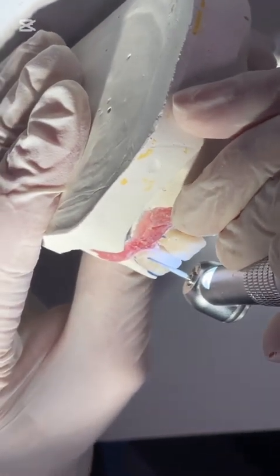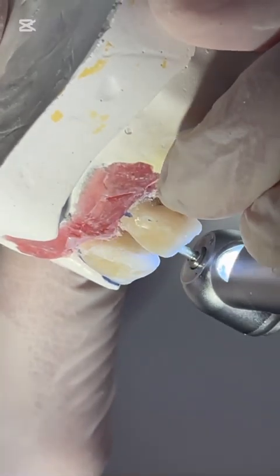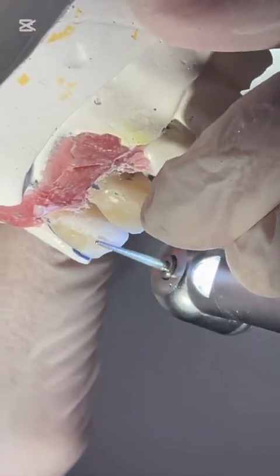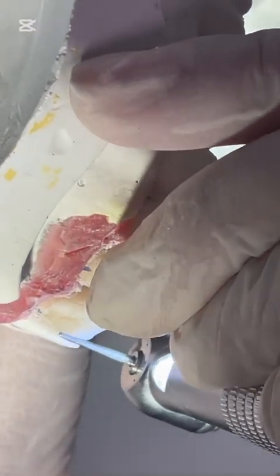So I will do beveling, beveling, beveling. Why am I doing beveling now? Just like you said, to remove the interproximal area.